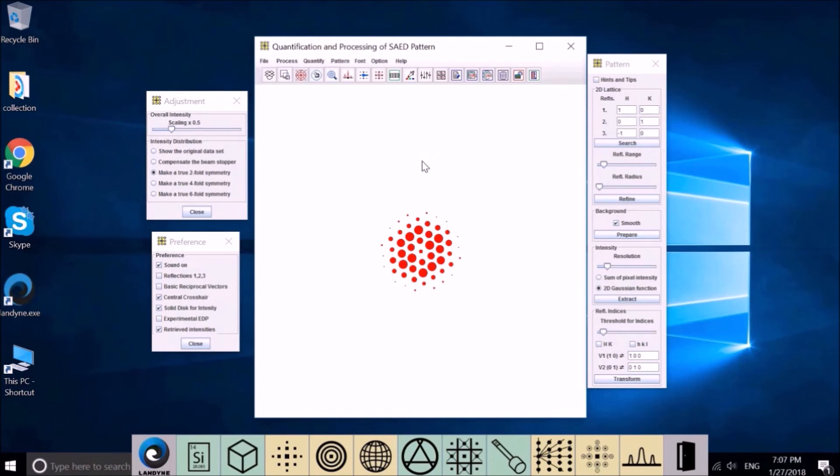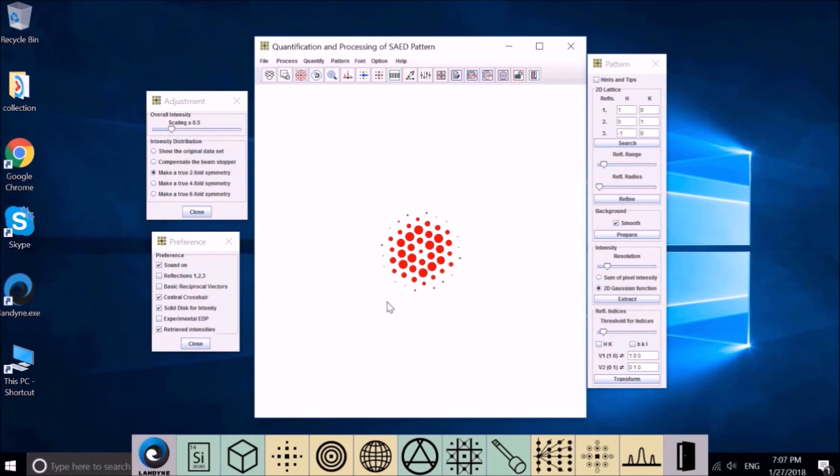The retrieved diffraction intensity can be used to replace the Fourier intensity of a high-resolution image to get an enhanced high-resolution image. This software will be added to Landyne software suite soon.